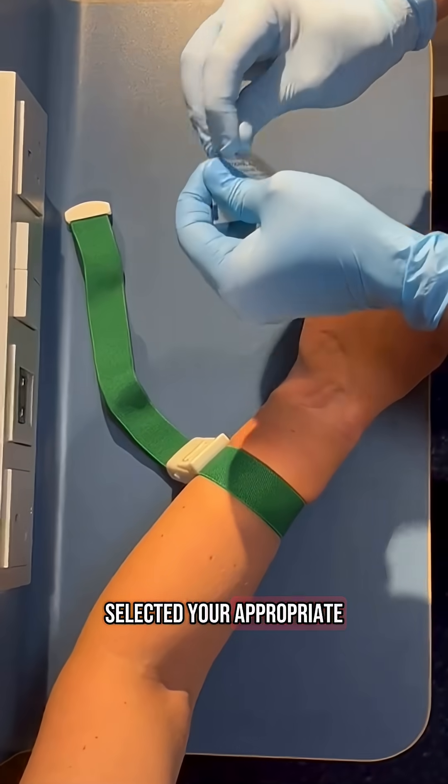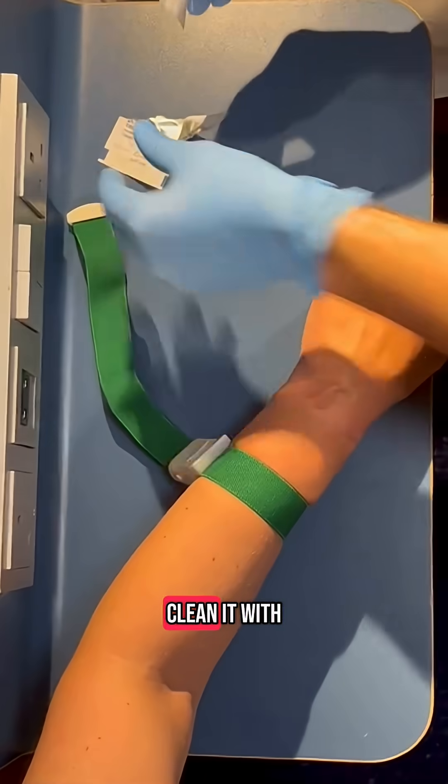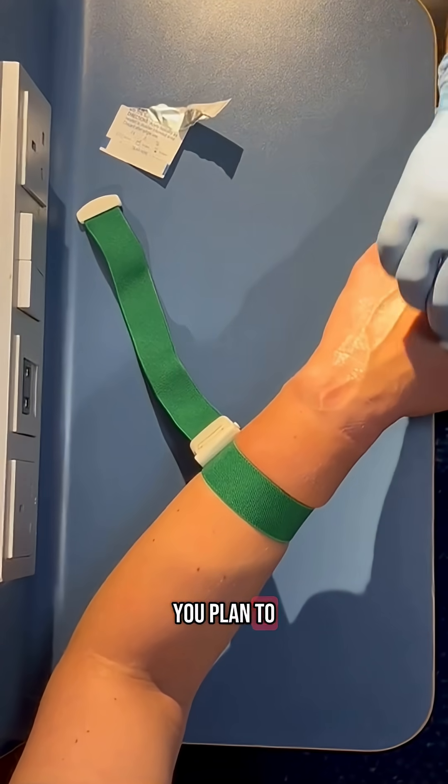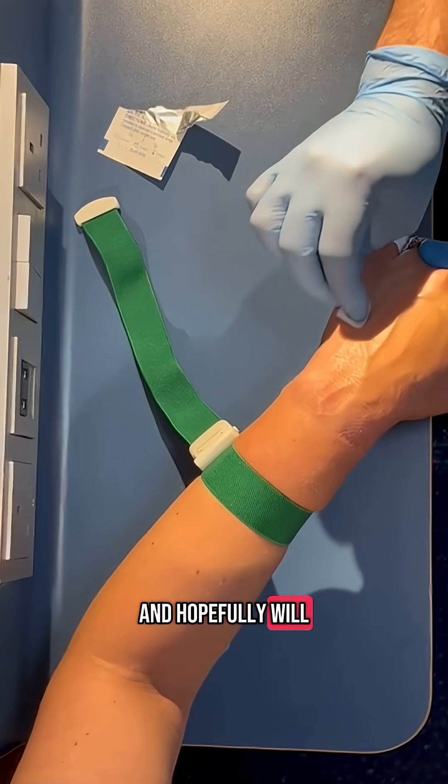When you have selected your appropriate large and juicy vein, clean it with an alcohol wipe using outward circles. This cleans the area in which you plan to insert your cannula and hopefully will mitigate infection.